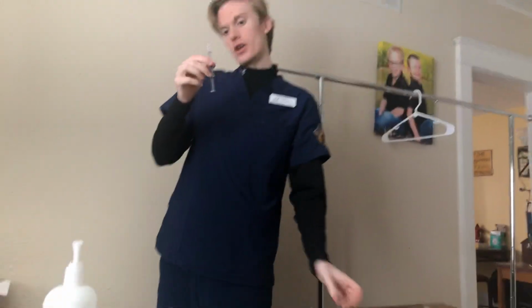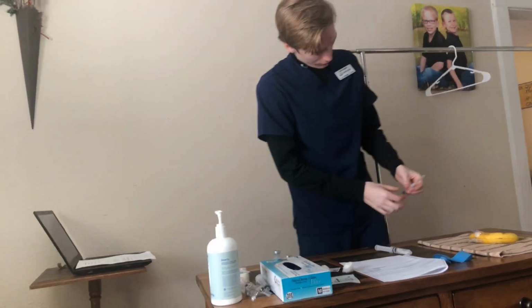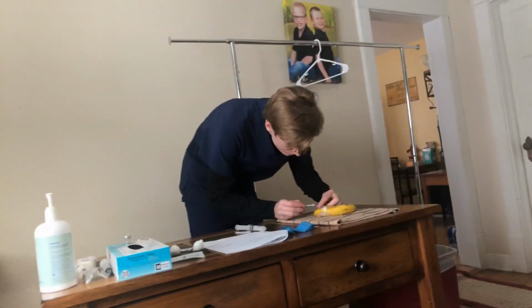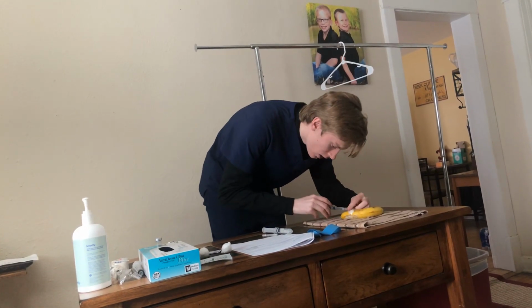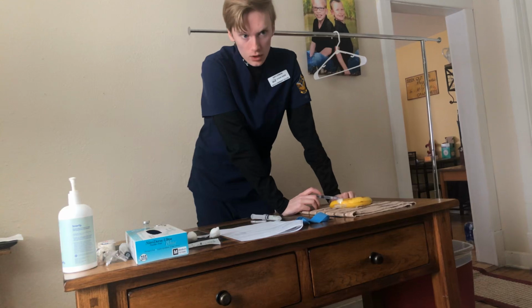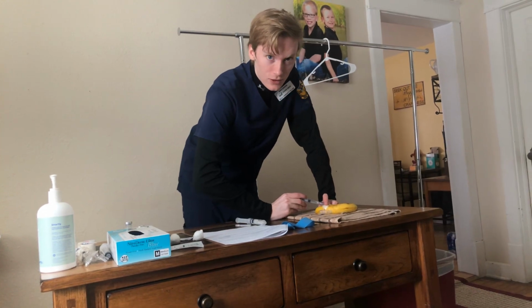Now, I'm going to ensure again that we have 3 mils of medication. Have another nurse look. Good. We're good to give it. So, I already flushed with 5 mils, and now we are good to inject our med. And then I'm going to do this over a span of 2 minutes. As the order says, give 1 milligram of Dilaudid over 2 minutes. But for the sake of this, we are just going to slowly give it in a quicker time span than 2 minutes.